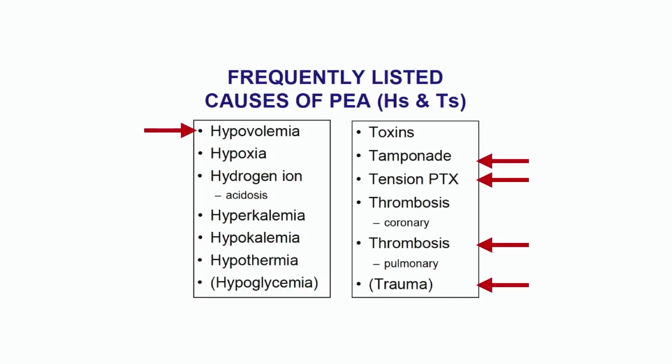So as we think about cardiac arrest, we oftentimes talk about those H's and T's, the 5 H's, 5 T's, of I guess more than 5, of the things that are reversible in cardiac arrest. And if there's a reversible cause, let's try to reverse it. We've talked about a number of them today that we can identify with ultrasound, and I've highlighted them here with the arrows, with hypovolemia and tamponade or tension physiology, the PE. We've talked about trauma exams in other lectures.